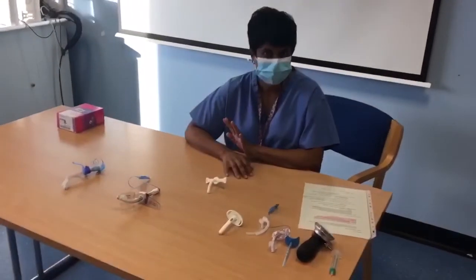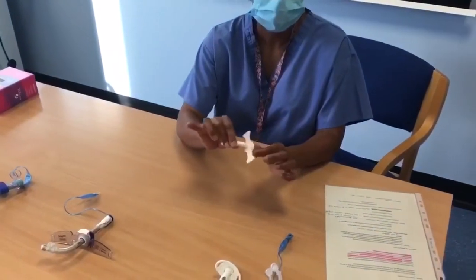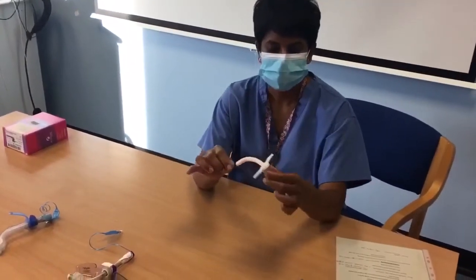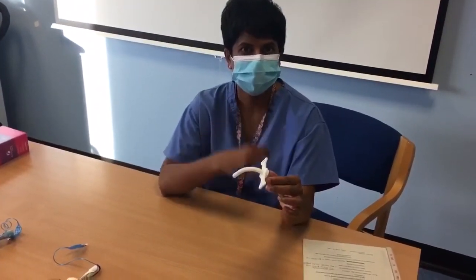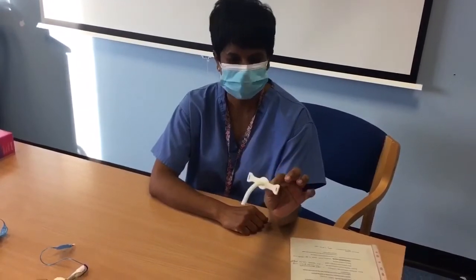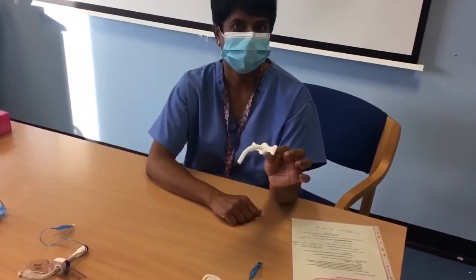So the last tracheostomy tube I'm going to show you is called the Bivona tracheostomy tube, and you'll notice that it's quite flexible in comparison to the other tubes that we've looked at, which have been pretty rigid. Okay, the reason for the silicone is for patients who may have a very sensitive trachea, or are long-term patients. So we would probably consider using a Bivona tracheostomy tube. These can be cuffless, as I'm showing you here, or they may have a cuff.